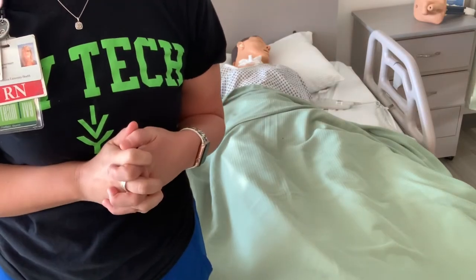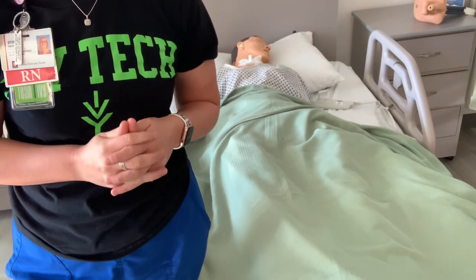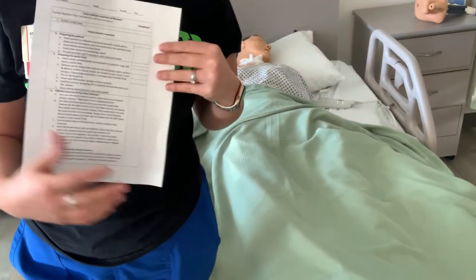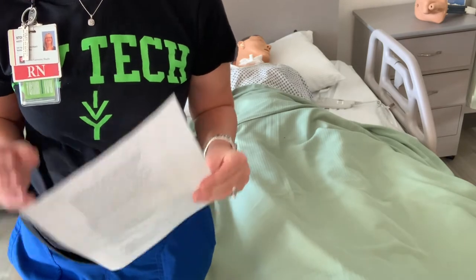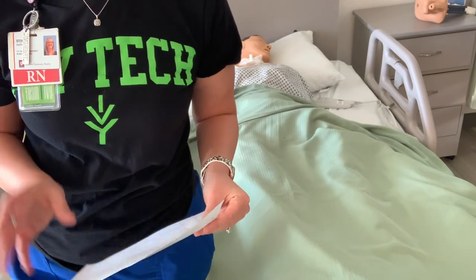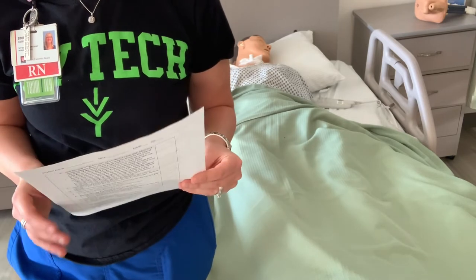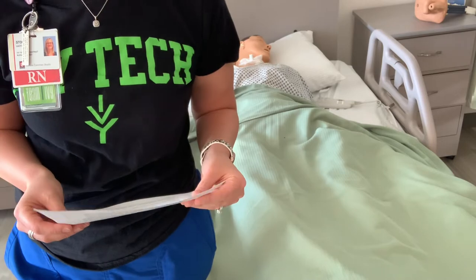Hello, this is going to be a demonstration video for your Foley catheter insertion and removal check-offs. So first things first, if you look at your check-off sheet, which I have right in front of me when I show you demonstrations — this is exactly what we expect out of you when you guys are doing your check-offs. Step one is always perform initial steps. That's in a separate document. The next thing is to gather your supplies.